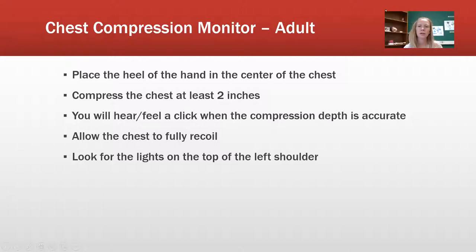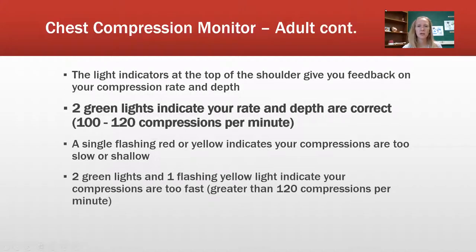The compression rate monitor and compression depth monitor are what we're going to look at next in the adult. Press the heel of your hand on the center of the chest. If you're not compressing the chest far enough, the lights won't turn on. If you're too slow, you'll see different types of flashing lights. Make sure you hear and feel the click when compression depth is enough, and allow the chest to completely recoil. Look for the lights on the top of the left shoulder — two green lights mean your rate and depth are correct at 100 to 120 compressions per minute. One flashing red light means you're not compressing deep enough; a flashing yellow means you're going too fast.